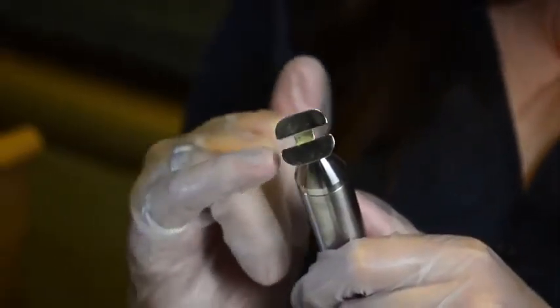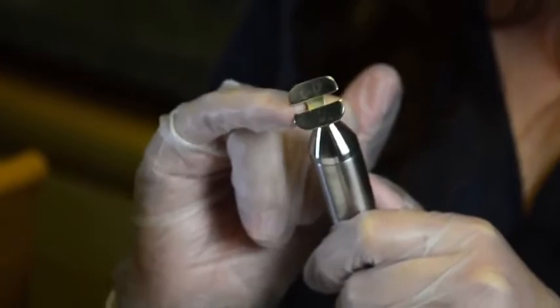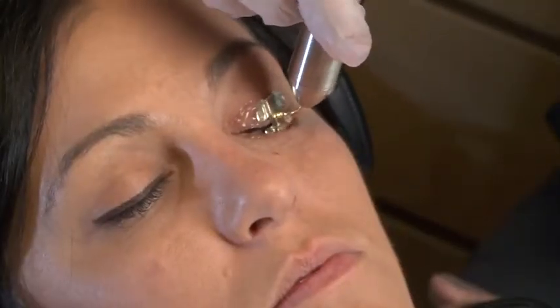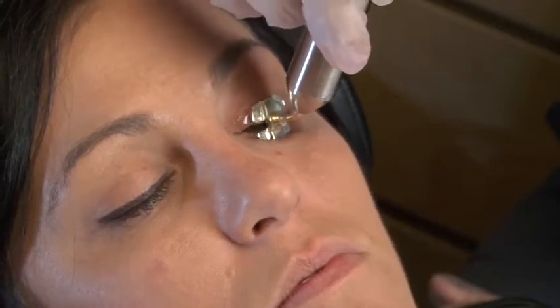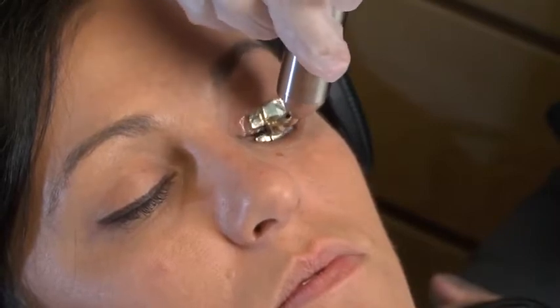When using the Dual or Elite iPad, make sure that you keep the eyelash line in the center of the iPad. Now hold the iPad in one spot and start with slight massaging circular motions and light pressure to evenly apply the iPad to make contact with both the upper and lower eyelids.